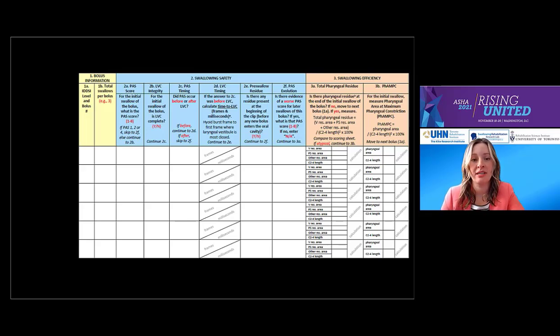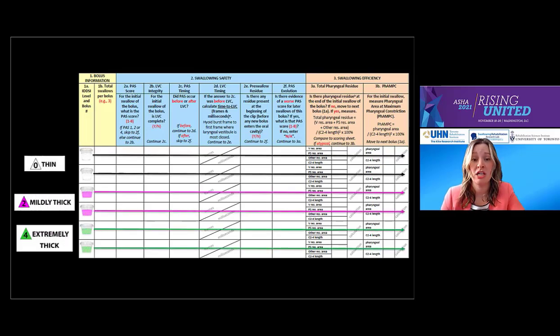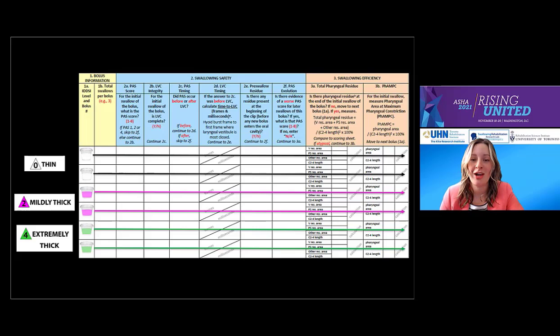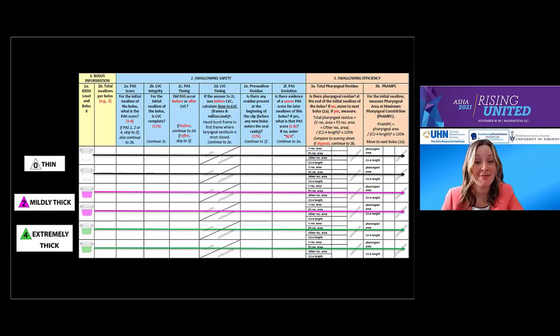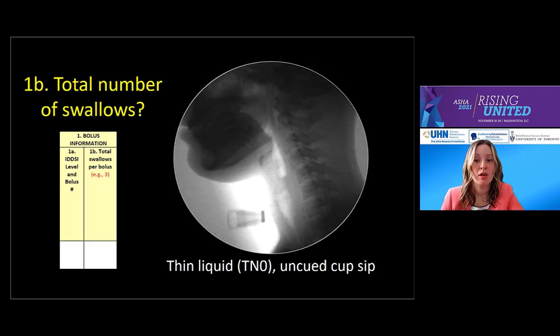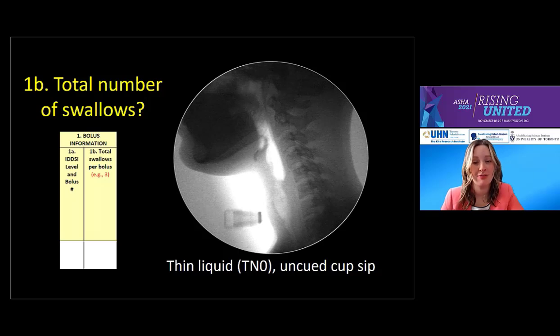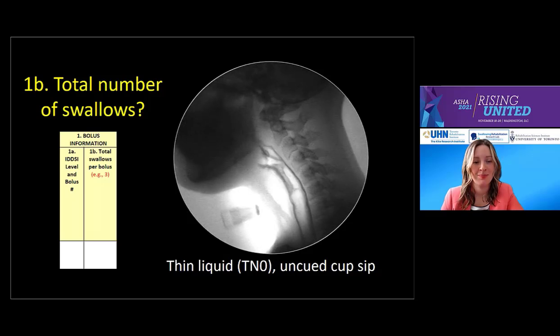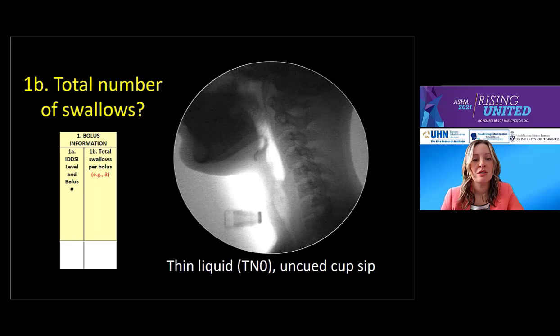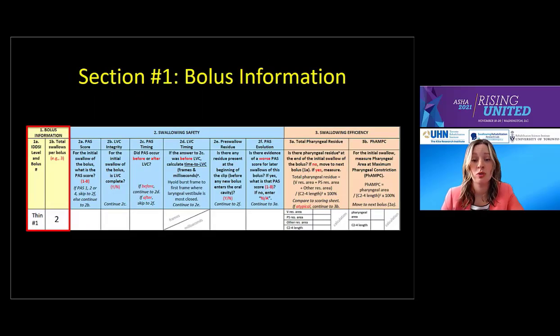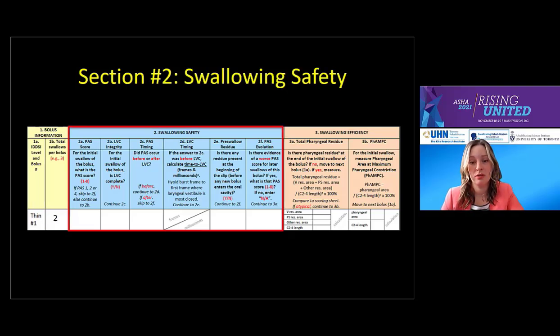Let's dive into our first case — an uncued sip of thin liquids. The first section is bolus information in the yellow column: count the number of swallows in the clip. This bolus was thin, it was the first bolus in our fluoro sequence, and there were two swallows. We then move on to swallowing safety, in blue. ASPECT-C uses a modified eight-point PAS score, broken down into two categories: green, or typical, and red, or atypical. PAS scores of one, two, and four are considered typical because they occur in healthy swallowing and involve no residual material in the laryngeal vestibule after ejection.